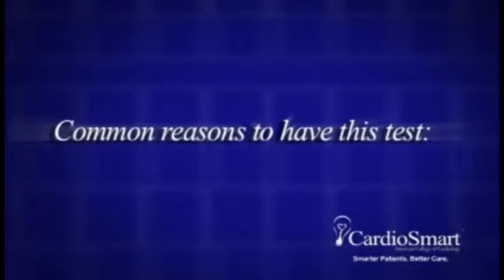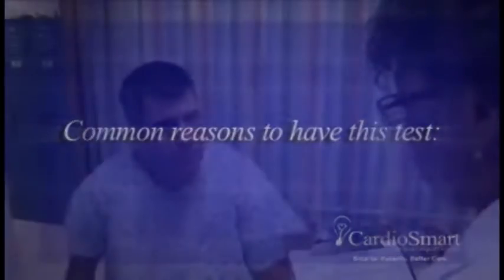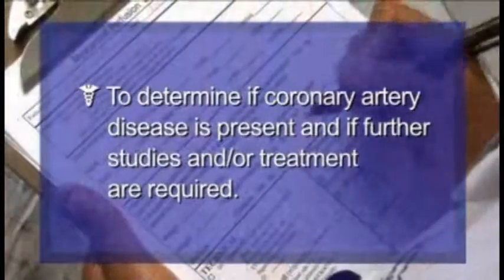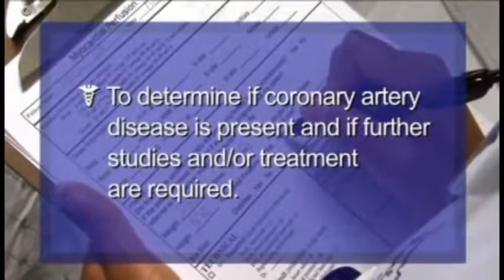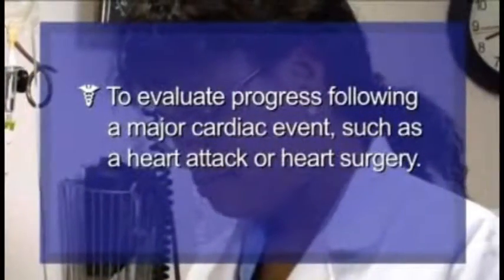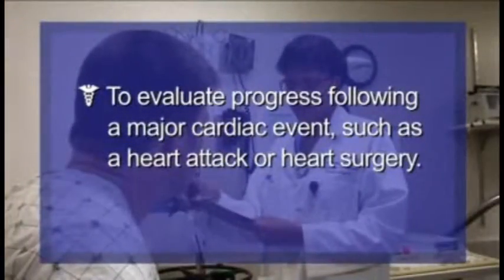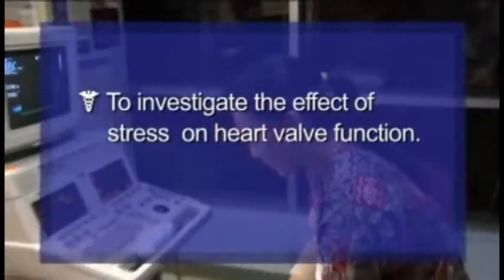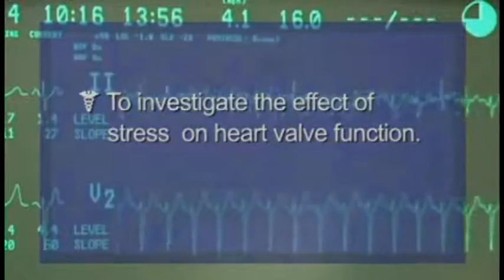Common reasons to have this test include: to determine if coronary artery disease is present and if further studies and/or treatment are required; to evaluate progress following a major cardiac event, such as a heart attack or heart surgery; and to investigate the effect of stress on heart valve function.